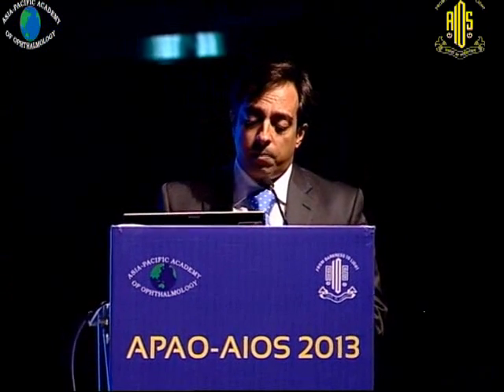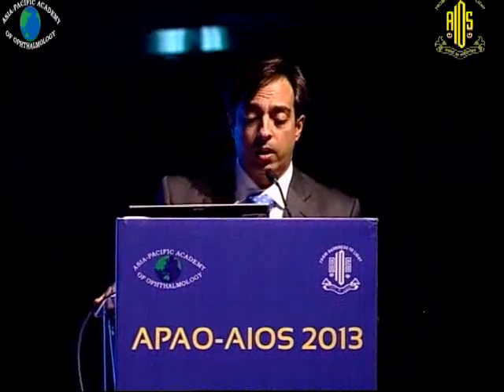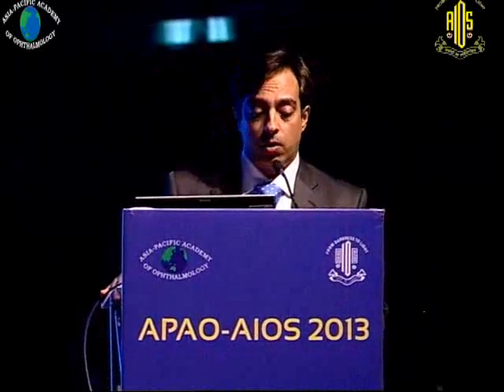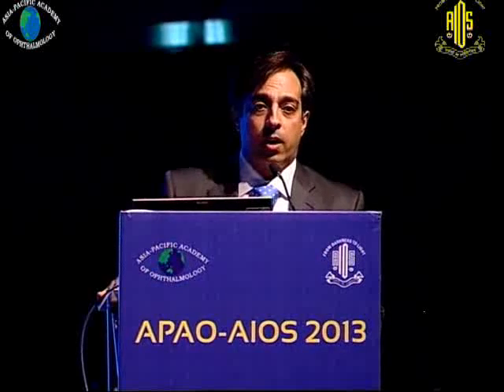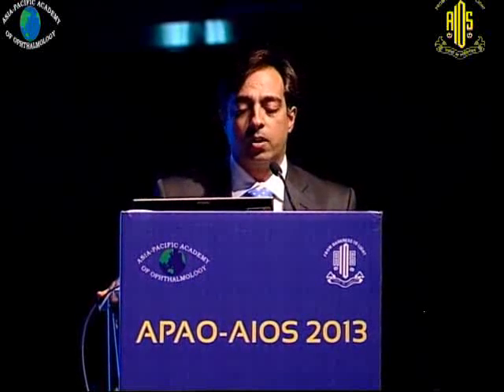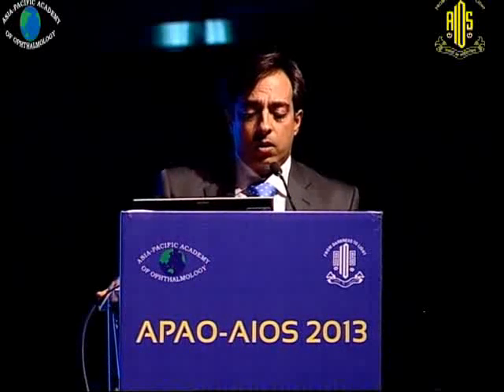So typically what we approach it as nowadays is to stain it with triamcinolone in any case of a macular hole or a pucker, or any case that we are trying to use it. We need to stain it with triamcinolone to get a better visibility. Otherwise we are not sure how well you are seeing it or grasping it, and once you have stained it, you know exactly how to grasp it within the port of the cutter or whatever instrument you are using, and then pull at it to confirm that the hyaloid is eliminated from there. So this is for a typical hole.